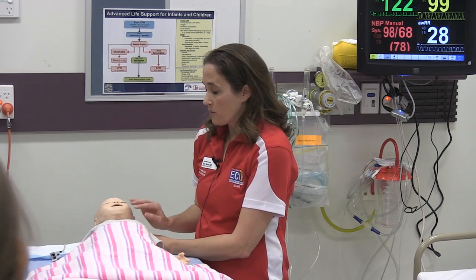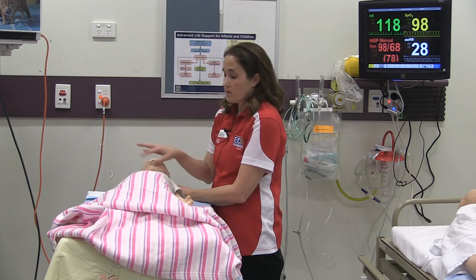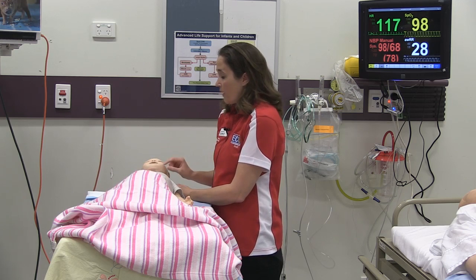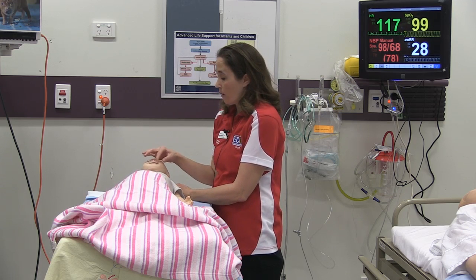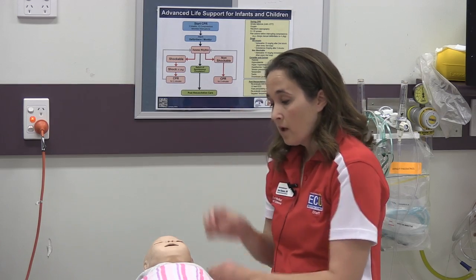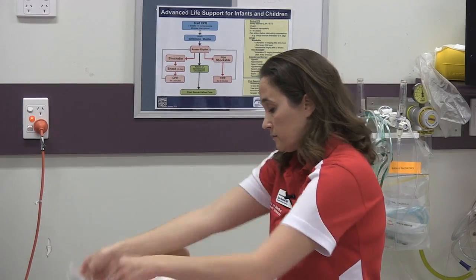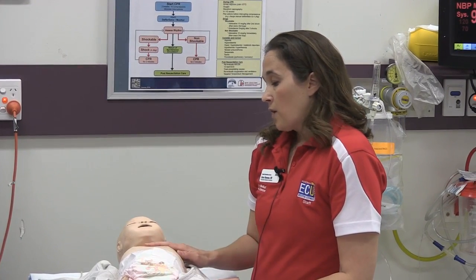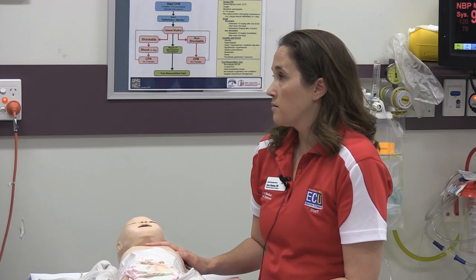The one thing that you really have to be careful with is no liquids down the mouth, because obviously it goes right into its electrical components here. This mannequin can become cyanotic, so it gets a little bit of a blue ring around its mouth. You can see that this mannequin also is breathing at the moment, so you can count respirations. It also has the capability from the console computer to change heart and lung sounds.